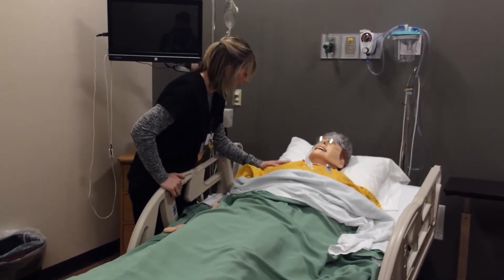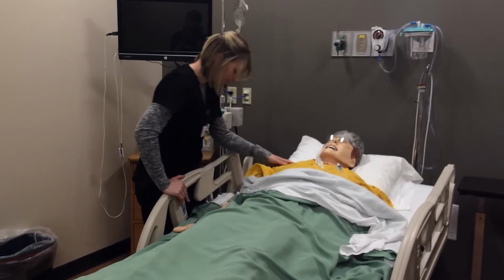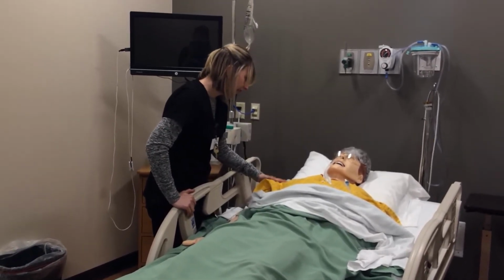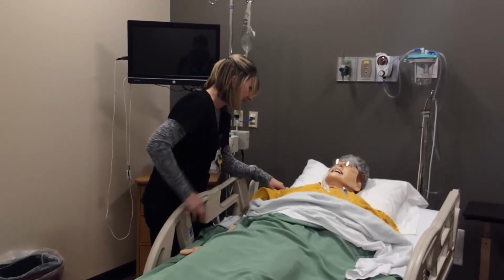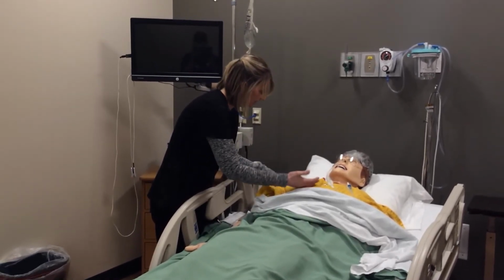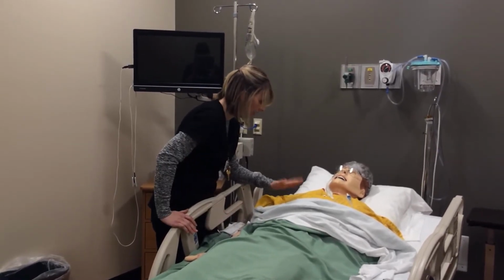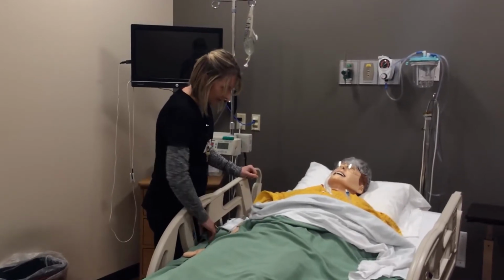Okay, the doctor has morphine ordered for you through your IV, so I can give you something to help with that pain. I also have another IV push medication that I'm going to give to you. It's called Solumedrol. That is a steroid. It's basically because you have that history of COPD, and I saw that you usually take prednisone at home. So we're going to give you Solumedrol while you're here, through your IV, and it's kind of the same type of thing as prednisone. It's going to help decrease the inflammation in your lungs, hopefully keep you breathing pretty good here.